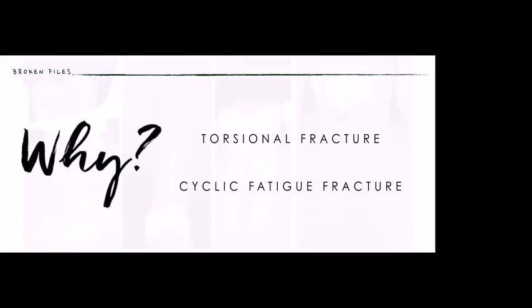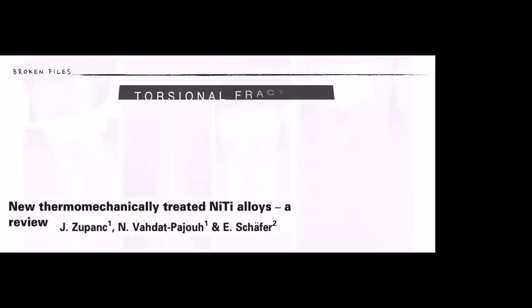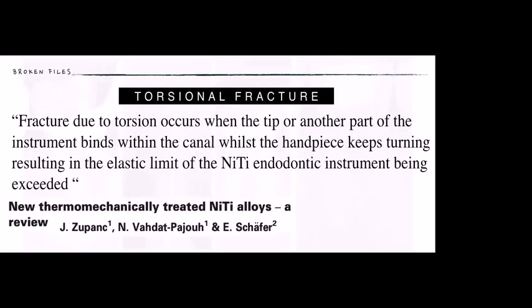The fracture can happen due to torsional stress or cyclic fatigue stress. And in some cases, the fracture will be due to a combination of torsional and cyclic fatigue stress. Now, first, we are going to start talking about the torsional stress. Why? Because if we know perfectly how to decrease the torsional or the cyclic fatigue stress, we are going to decrease the number of fractures in our clinical practice.